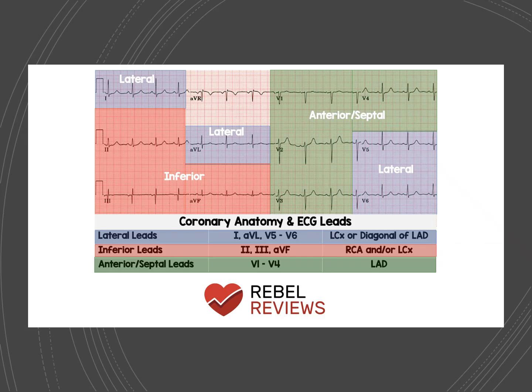Now that we've covered the correct lead placement, let's connect the dots to what each lead actually tells us about the heart. This chart breaks down which part of the heart each lead looks at and how it maps to the coronary arteries.